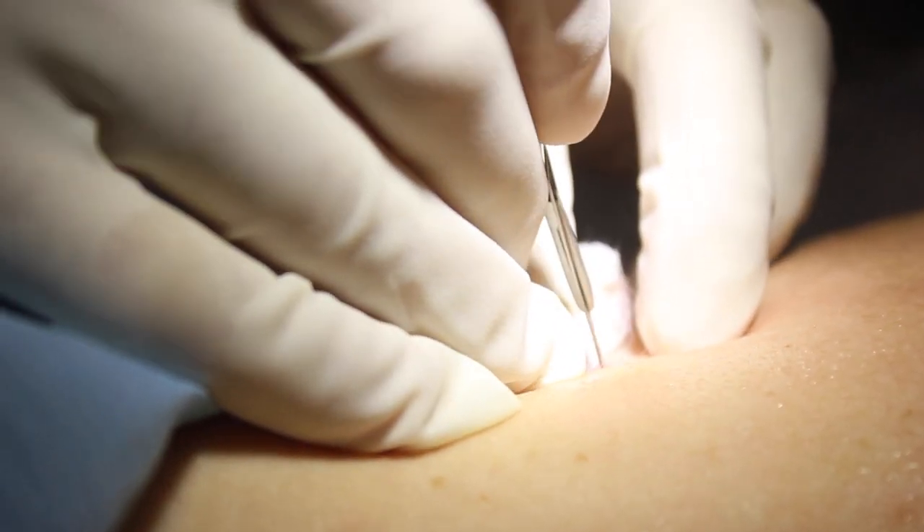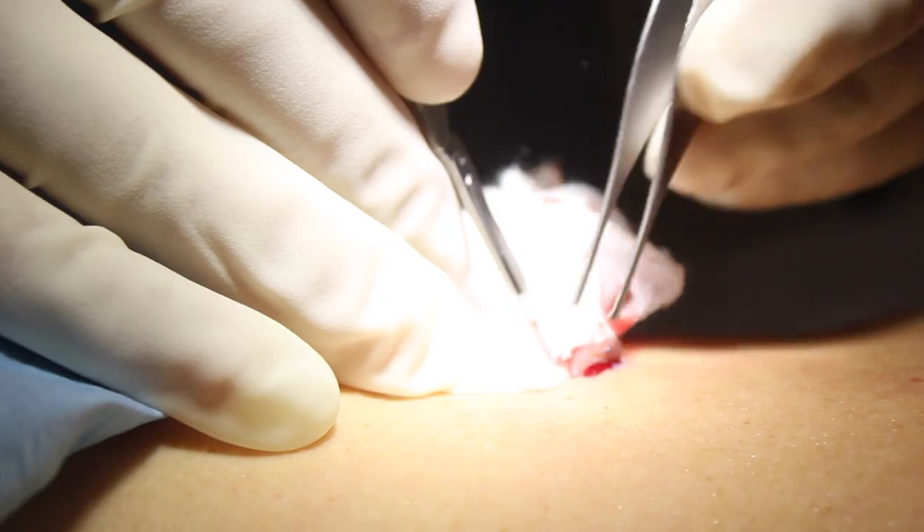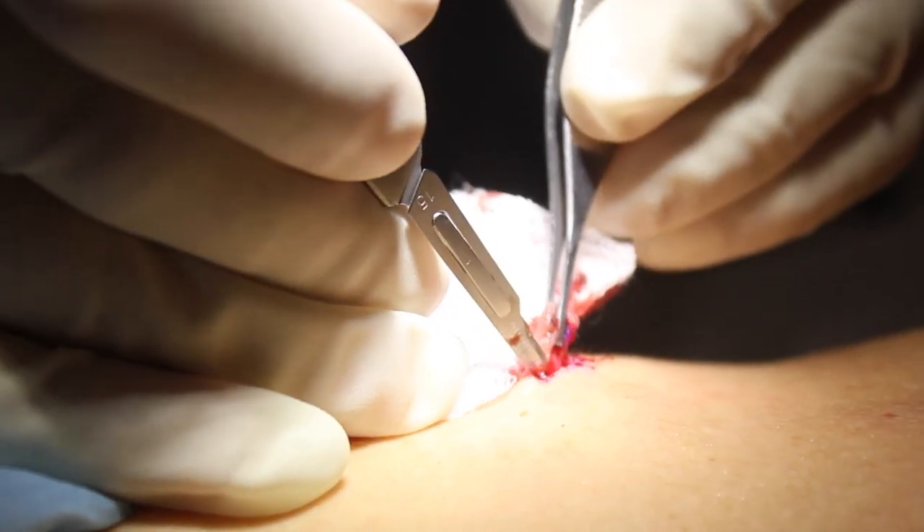I'm going really close to the edge of the mole with this because it's a benign mole — there's no worry that it's cancerous. She's not worried about it; it's just a nuisance. So I've taken a very minimal margin around the outside of the mole.